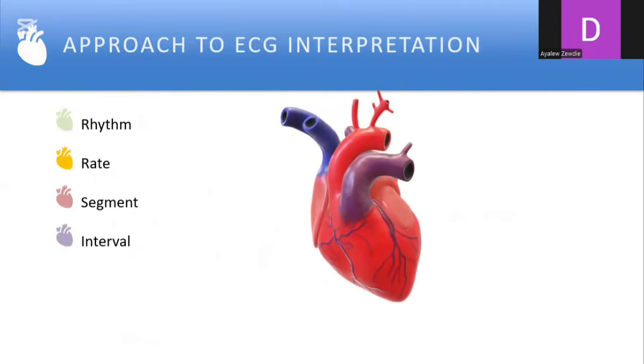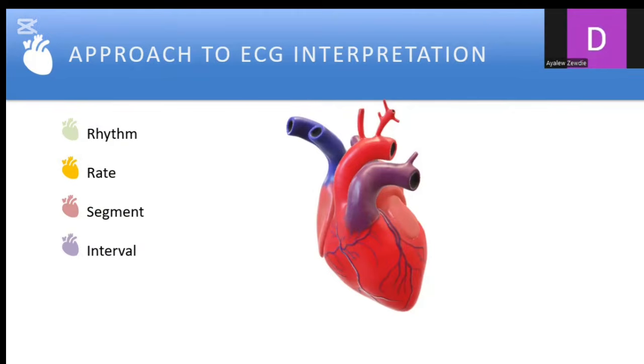So now let's go to the basics of ECG interpretation. Just the main ones. Anyone, whether you're a nurse or general practitioner, should at least know 4 things. For the others, you need to go into details. Maybe we'll do another session about the detailed interpretation. But at least know these 4.